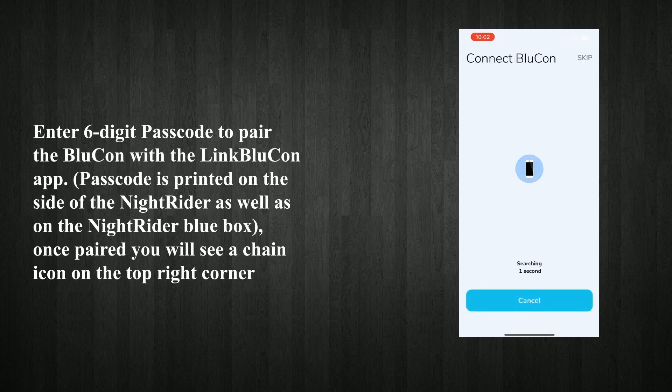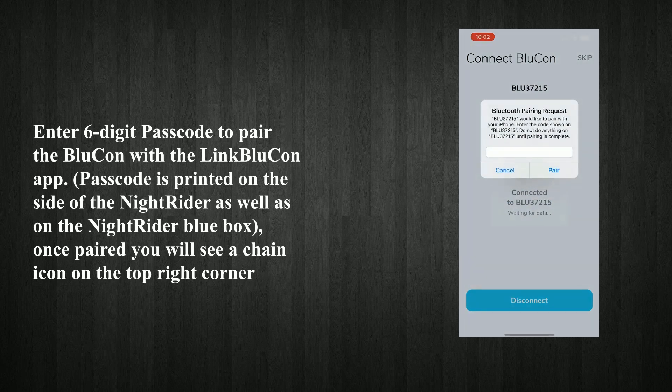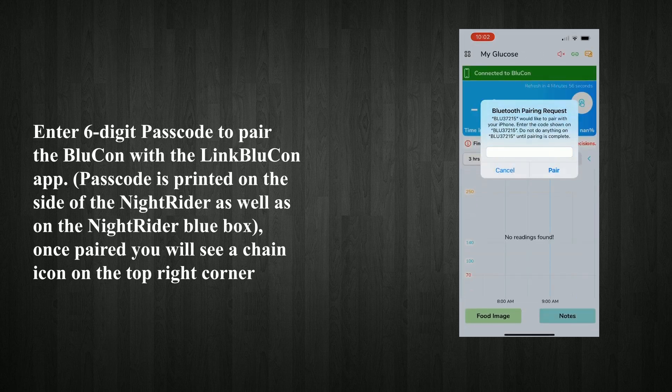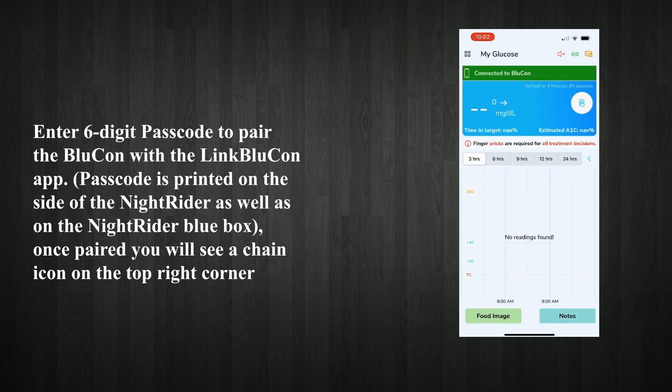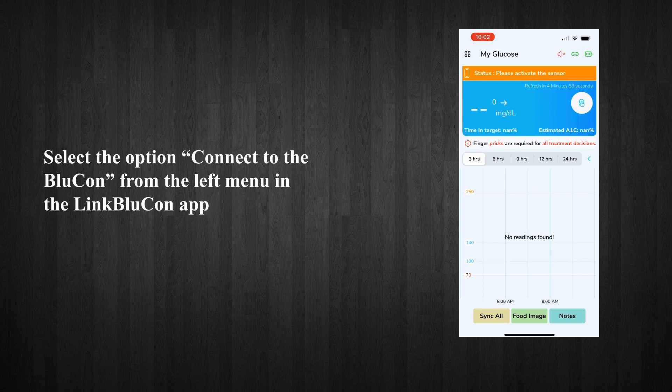Enter the 6-digit passcode to pair the Blucon with the LinkBlucon app. The passcode is printed on the side of the Nitrider as well as on the Nitrider box. Once paired, you will see a chain icon on the top right corner. Select the option to connect to the Blucon from the left menu in the LinkBlucon app.